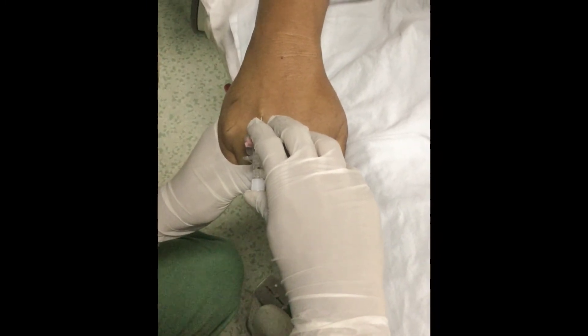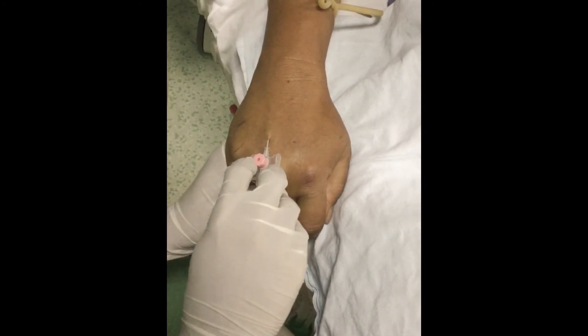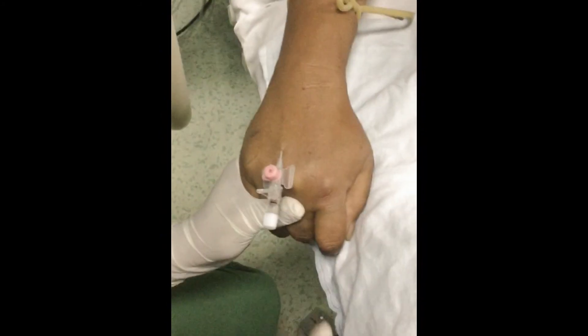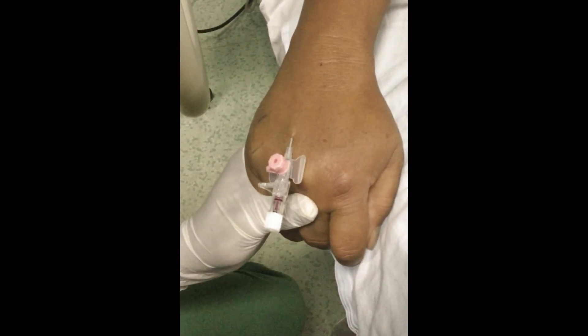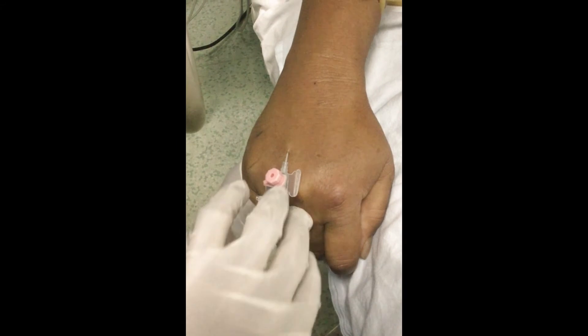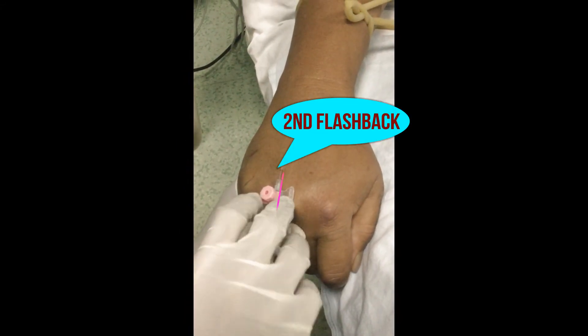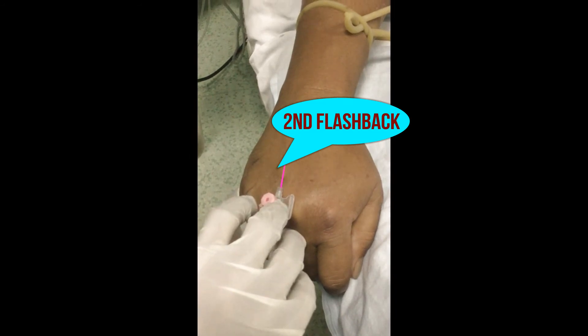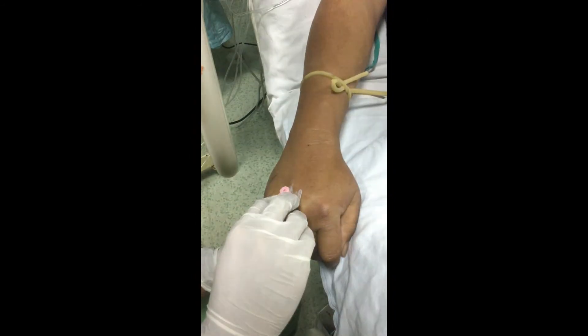Enter the vein in one quick motion. You can see the first flashback of blood. After the first flashback, straighten the angle and advance approximately 1/4 to 1/2 inch. Then you can see the second flashback. Then advance only the catheter into the vein.